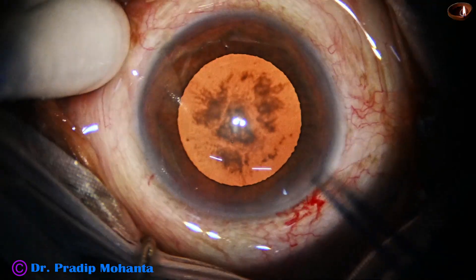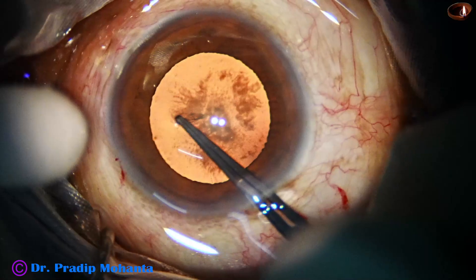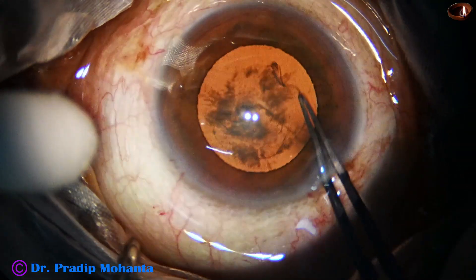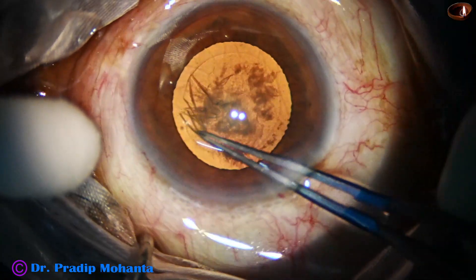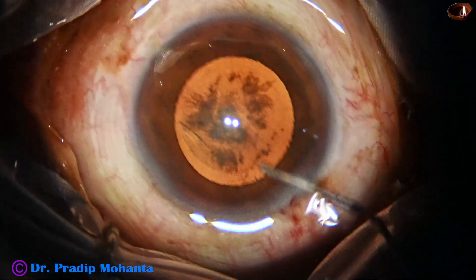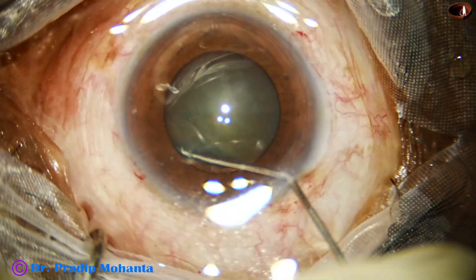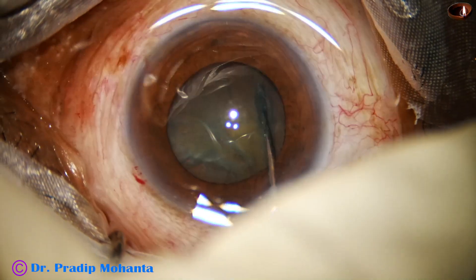Now we use the stereo coaxial illumination of the microscope. The microscope here is Lumera T. We get very good red glow and you can do this rhexis with the utrata forceps. Everybody must learn utrata as well as cystotome for doing rhexis.